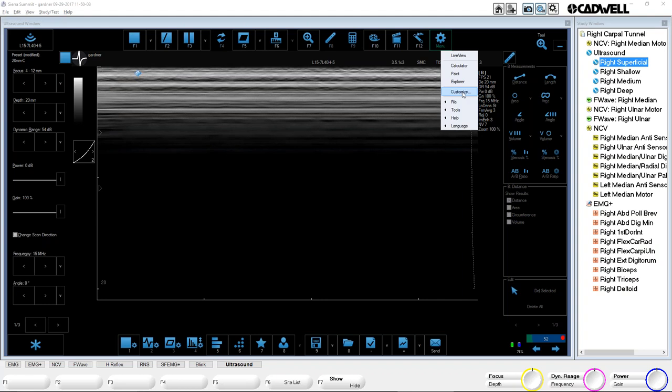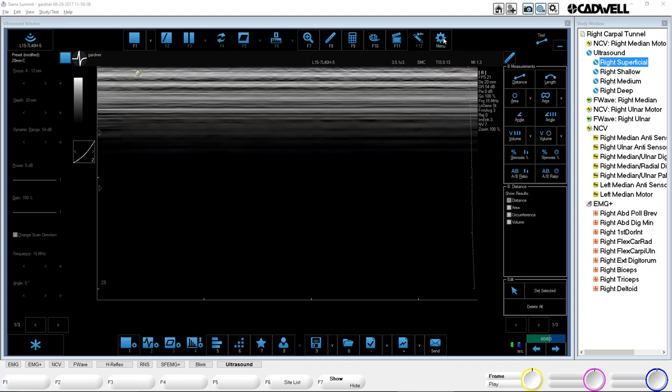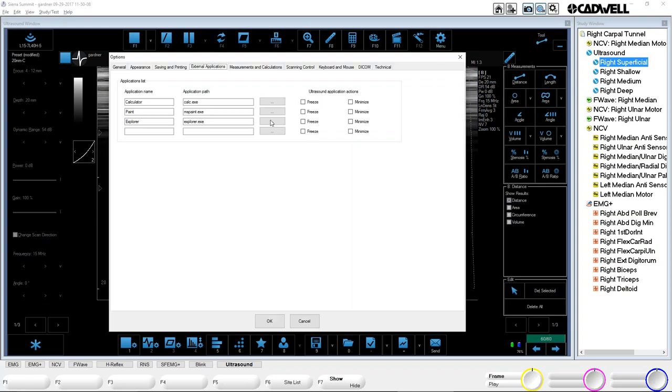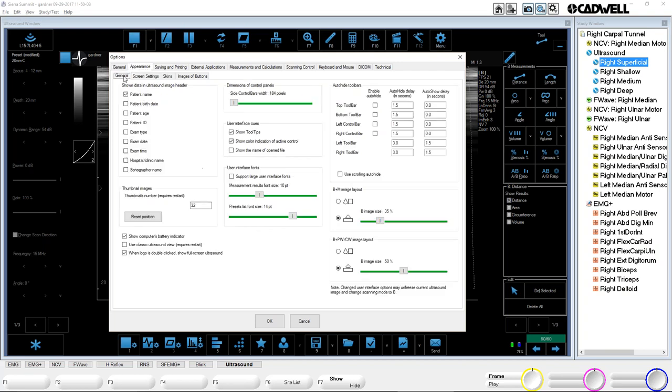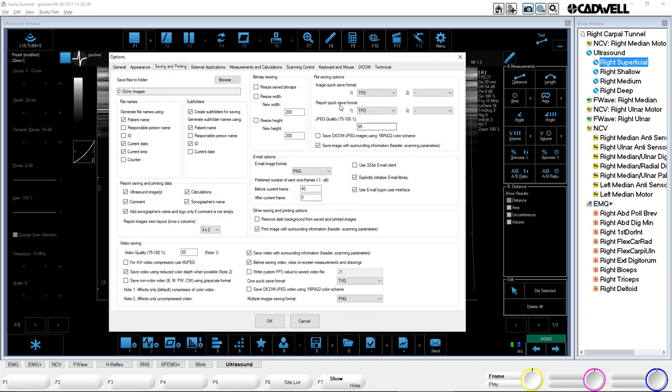Those are the main things I wanted to show. Let me go back — under Saving and Printing tab, make sure this is set for PNG. That's what our report needs to get the picture of the ultrasound. I usually set both to PNG. Make sure that's done — that's in the instructions as well.